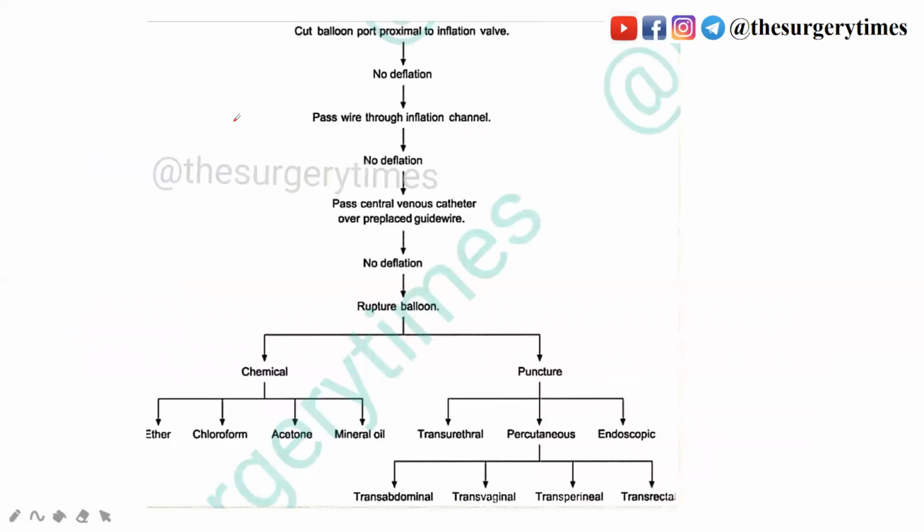Once there is difficulty in removal of the Foley's catheter, there are various ways to remove a difficult Foley's catheter. This slide is taken from a recent journal article. It says cut the balloon port proximal to the inflation valve, but it should not be done, because it also raises the difficulty level, but you should remember it is also a method.